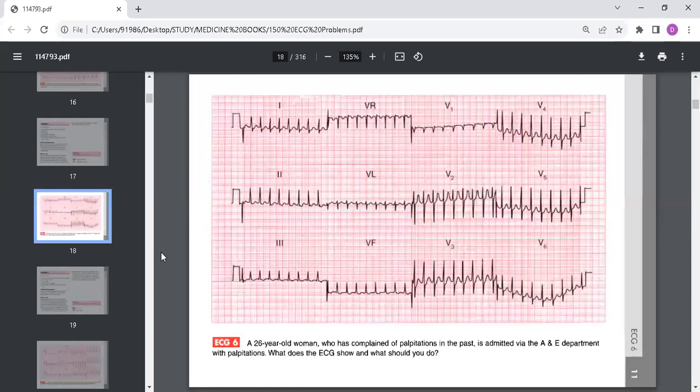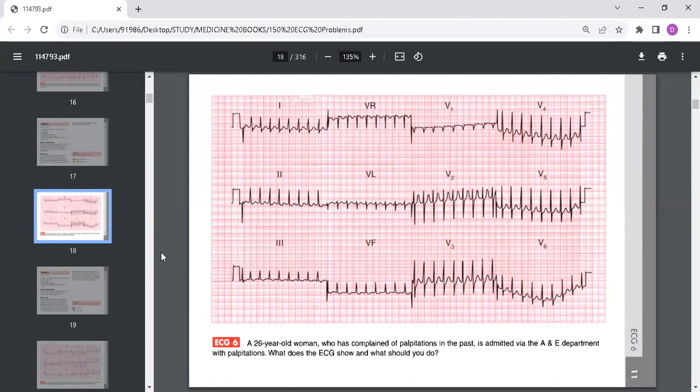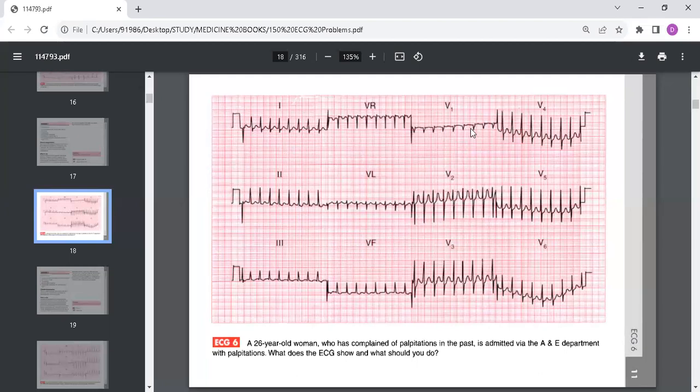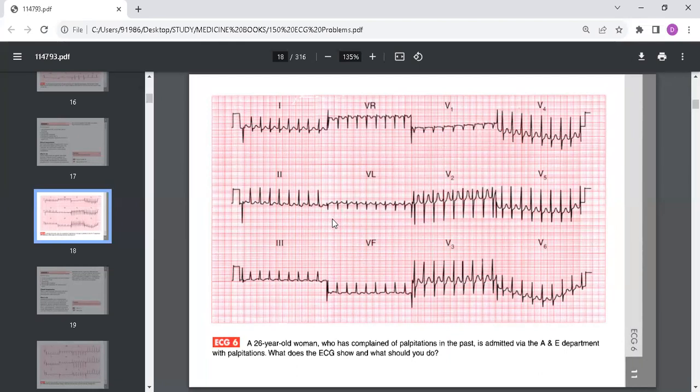This is an ECG of a 26-year-old woman who has been complaining of palpitations in the past and is admitted to the hospital via the accident and emergency department with palpitations. What does the ECG show and what should you do? This ECG shows narrow complex tachycardia with a rate of about 200 beats per minute. There are no P waves visible. The axis is normal, the QRS complexes are regular and normal. ST segment is normal, T waves are normal.